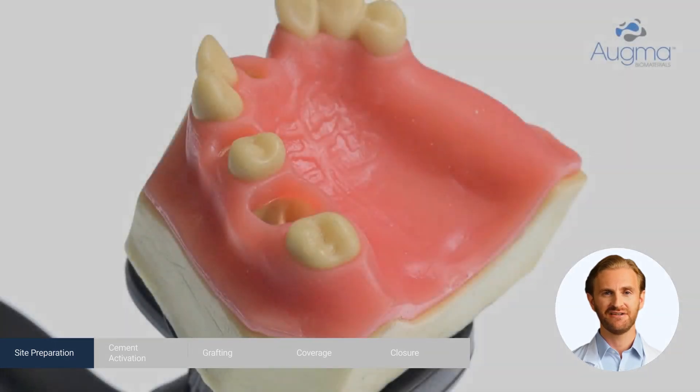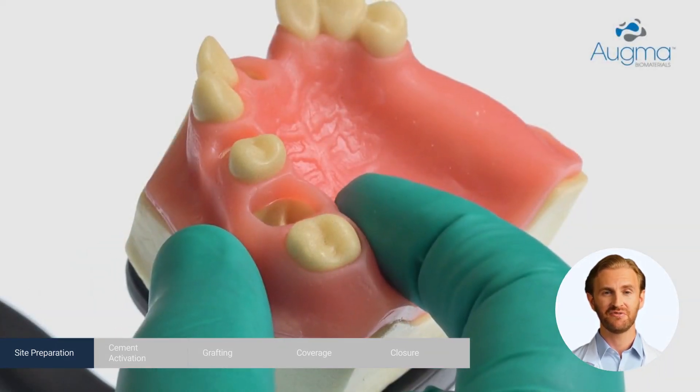After extraction, perform a complete debridement, including the removal of granulation tissue.